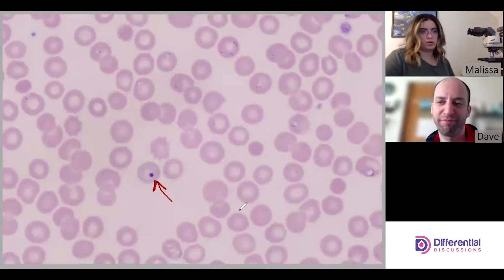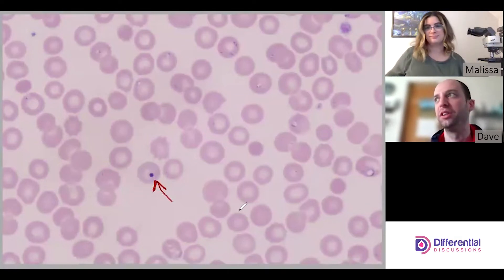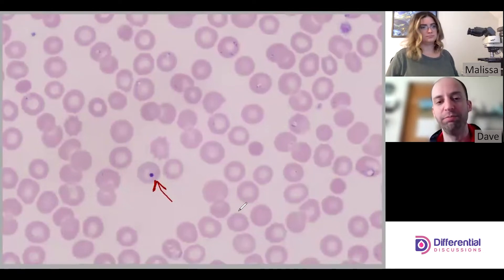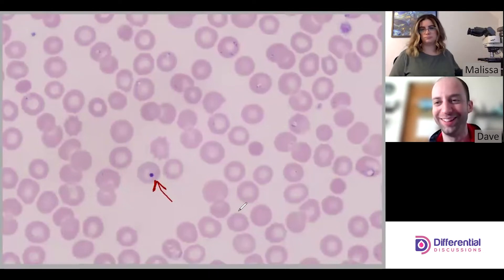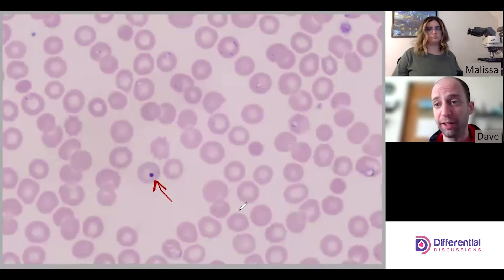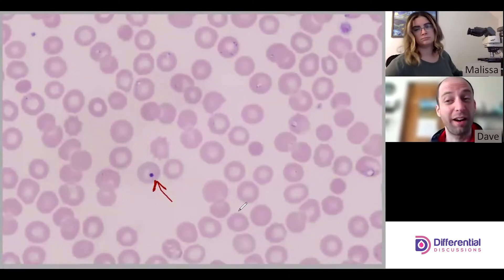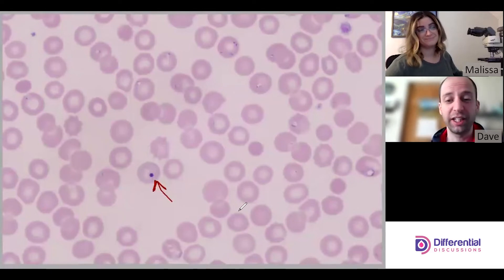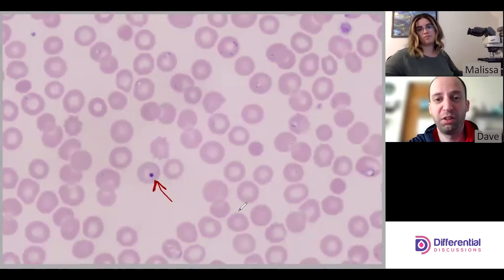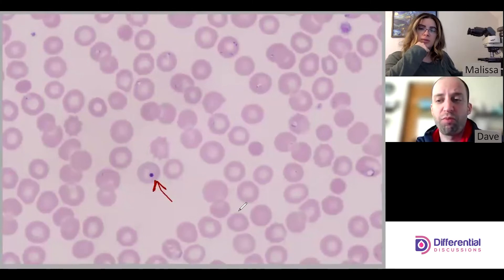A Howell-Jolly body indicates some kind of stress where DNA material is not being completely removed from the red cell. One of the things that quickly comes to mind is how well the spleen is functioning — or whether there is a spleen at all. The spleen is a really important hematological organ whose job is to facilitate the removal of inclusions and red cells that aren't fit for physiological function. Seeing this many Howell-Jolly bodies alongside this many parasites is very suggestive that the spleen is not functional, which might be why parasitemia is so high.